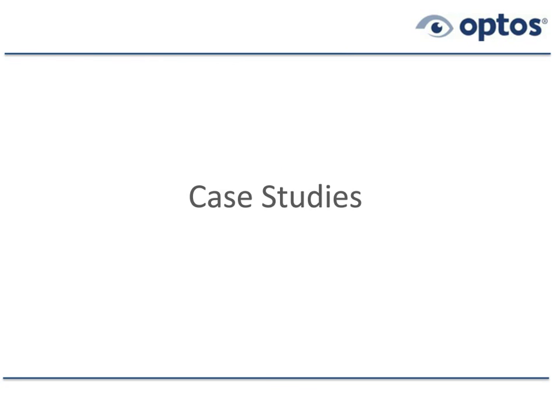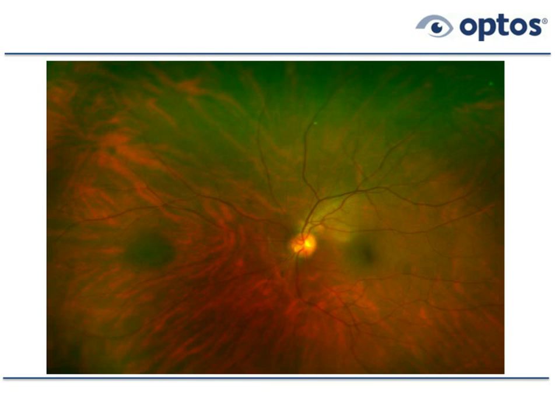Let's begin case studies with a choroidal nevus — a lesion that exists at the level of the choroid. This is an ultrawide field color image showing a darkly pigmented lesion in this left eye, nasal to the disc. Nevi occur in about 10% of patients imaged with ultrawide field. The composite Optos image gives us access to red laser and green laser separation. The red laser penetrates deeper and allows us to see choroidal vessels; the green laser doesn't penetrate beyond the RPE.